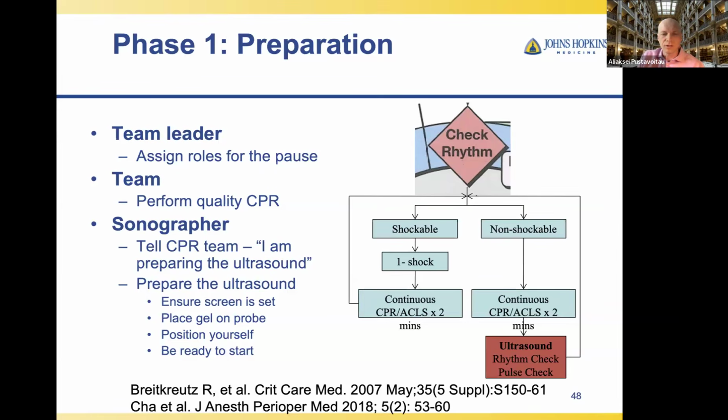And start preparing. What it means is the screen is set, right? It's a preset for deep scanning, like 20 to 22 centimeters or so. Gel is already on the probe. They position themselves such that they don't interfere with chest compressions, and they're getting ready to start. One other important thing is to hold a towel or some sort of material sheet to remove the gel as soon as they are done with ultrasound.